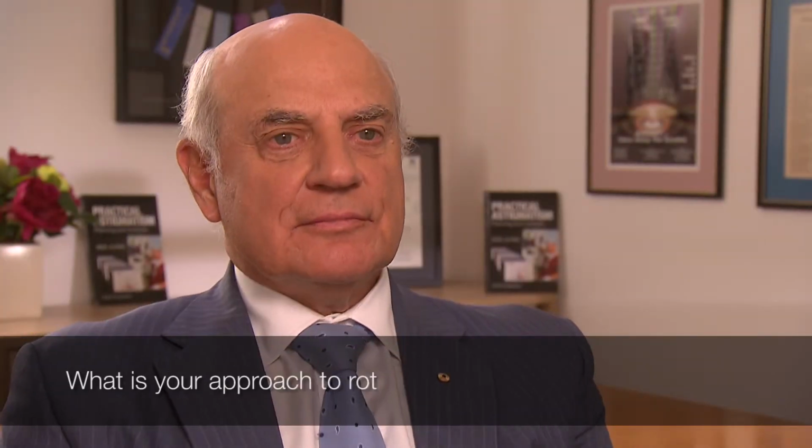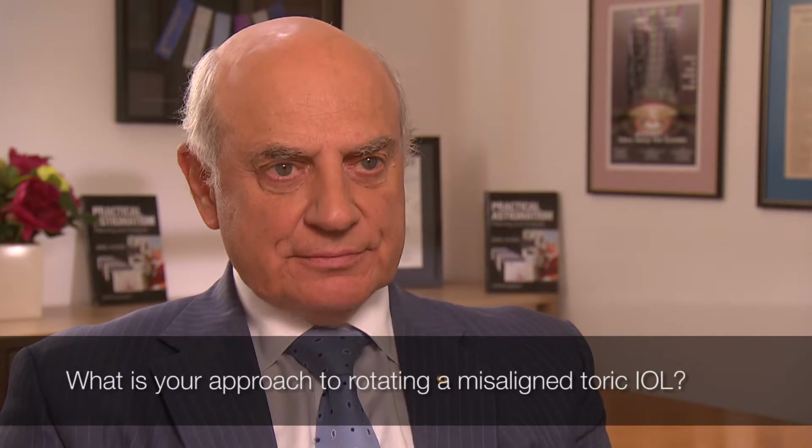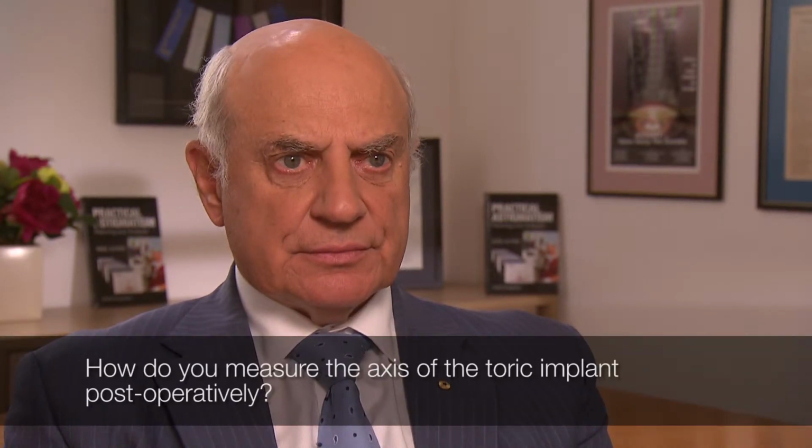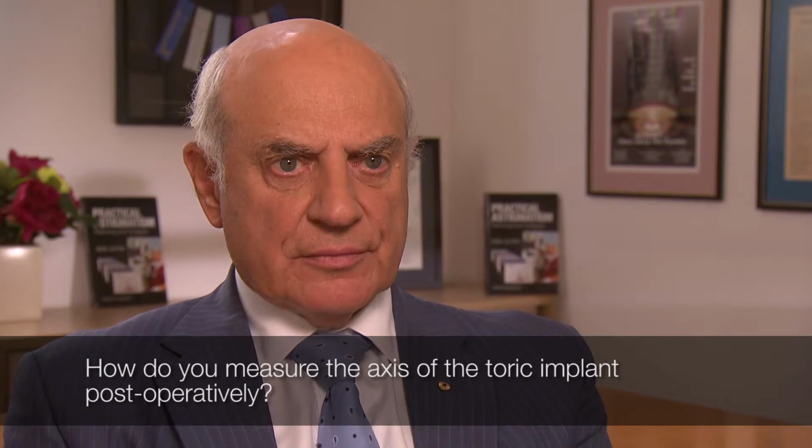What is your approach to rotating a misaligned toric IOL? A month post-operatively is a good time because tissue is able to fully heal by then. So the rotation is a relatively straightforward procedure, using viscoelastic to separate the leaves of the anterior and posterior capsule and going in through two separate new incisions 90 degrees apart so you don't change the astigmatic status of the eye.